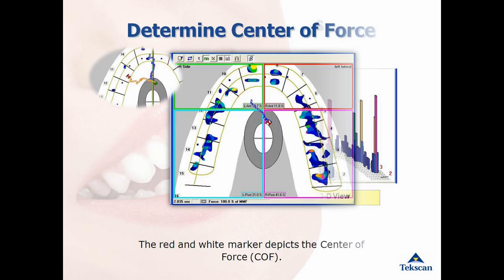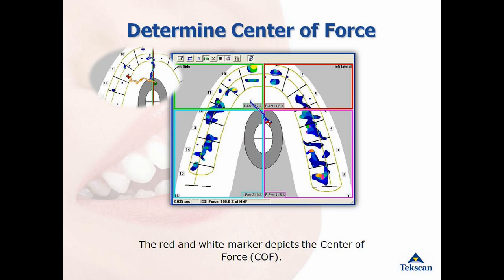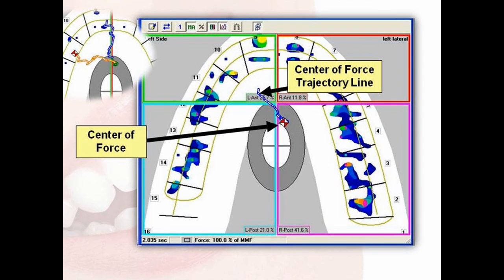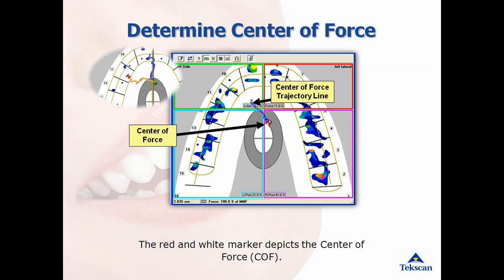Each T-Scan recording has a center of force trajectory line that displays the history of the patient's bite. The trajectory line is color coded to easily identify when the patient is occluding, holding down, or where the excursion begins. The center of force is a timeline of what happens throughout the path of closure. Each segment of the center of force trajectory line represents one click of the mouse, or one hundredth of a second in time.